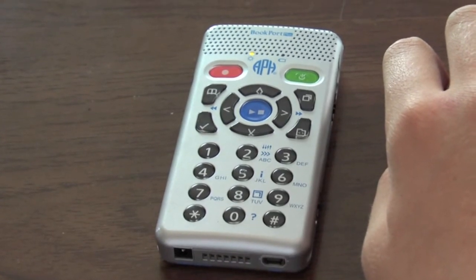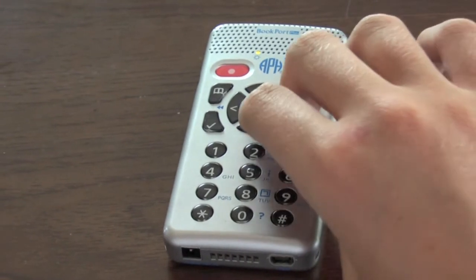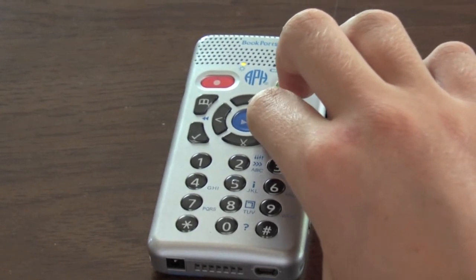Set. And it reads the time and date that we just set, and now when you hold the 5 key, it'll read that correctly. Let's go into the menu again. Menu. System. Left arrow. Enter. System. And let's just right arrow quickly. Keep date and time.